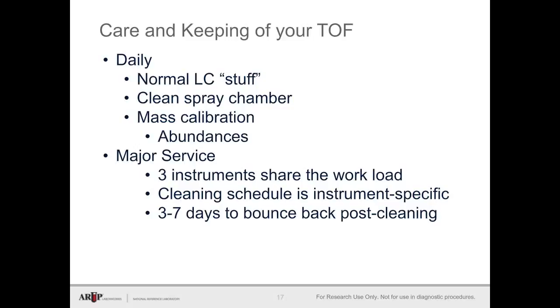The instrument itself is pretty easy to maintain from day to day. You do the normal LC stuff like checking the solvent levels and priming the pumps. Wipe the inside of the spray chamber down with a mixture of IPA and water, and then just do a mass calibration for the instrument. All in all, it takes less than 15 minutes.